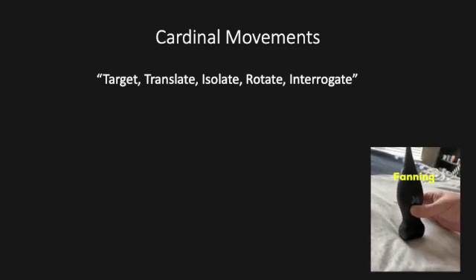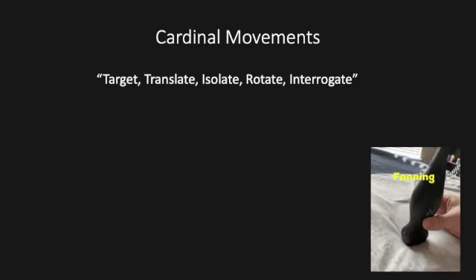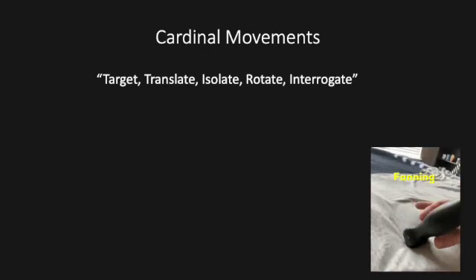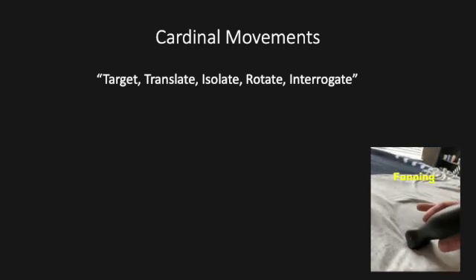So you can also refer to this as rocking back and forth, but you'll hear me say fan the probe, and that just means kind of pushing the probe forwards and backwards without sliding, and just changing the angle of insonation to be able to illuminate all of a structure. So those are your cardinal motions.